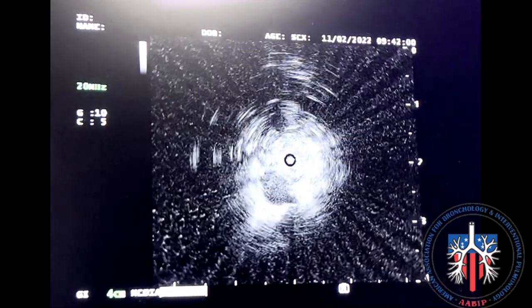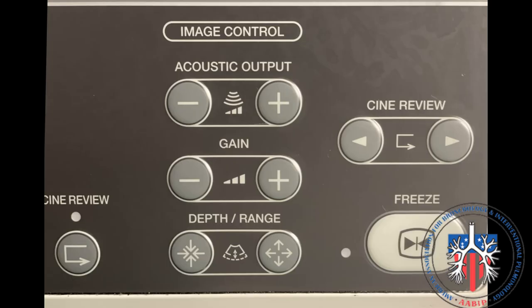Date, time, and patient identifiers can also be entered. Use these buttons on the keyboard to control gain, depth, acoustic output, and to freeze and unfreeze the ultrasound probe.